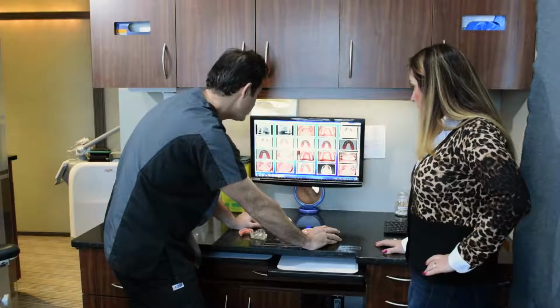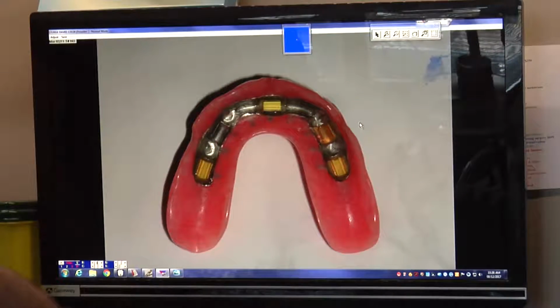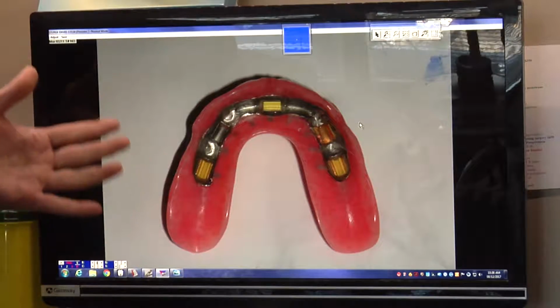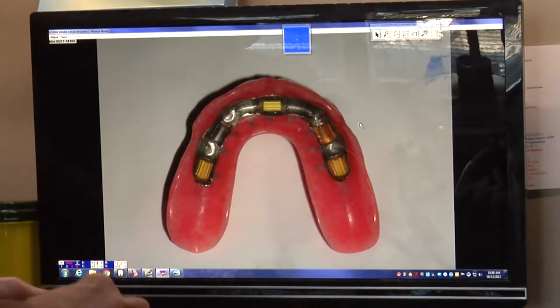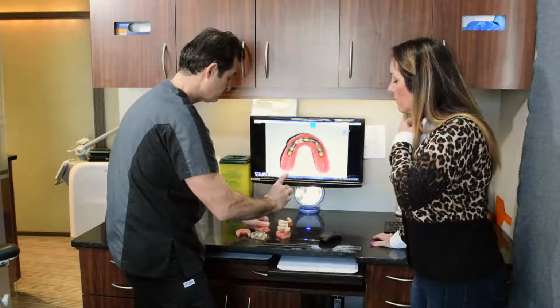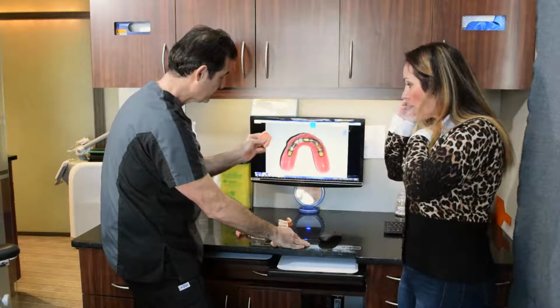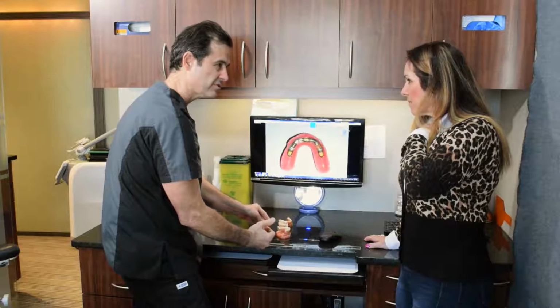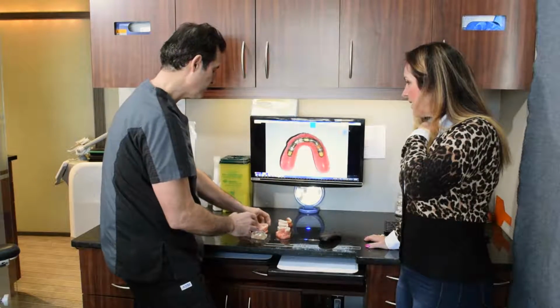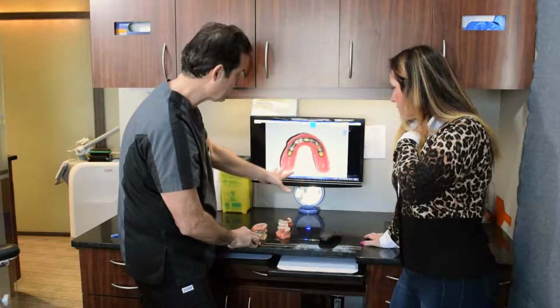And once the denture goes into place, so this is the denture. Now this is really a key factor of what we're talking about with a bar over denture. Now this is an upper, and you will notice here that the palate is open, which is a big change from a full denture where the palate is completely closed. When we have a closed palate, this alters your ability to taste things. You've got this thing on the roof of your mouth constantly there. So people who go for a bar over denture on top really enjoy the fact that it's more like having teeth again.